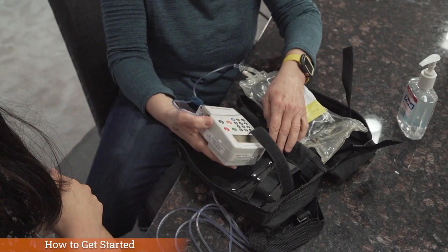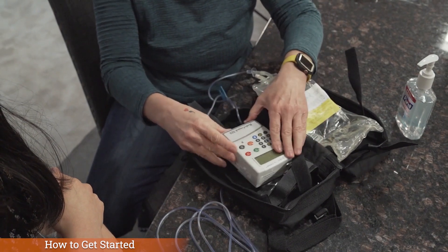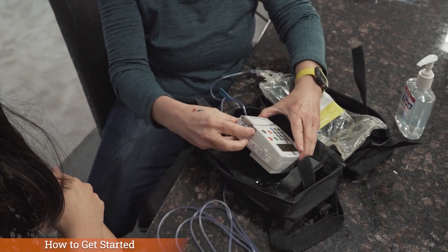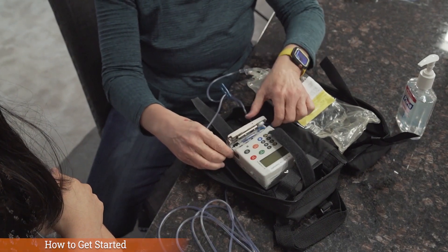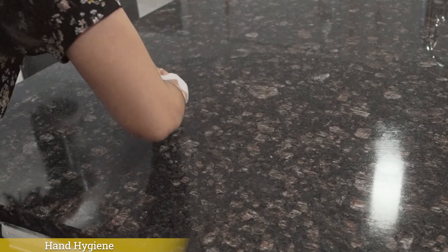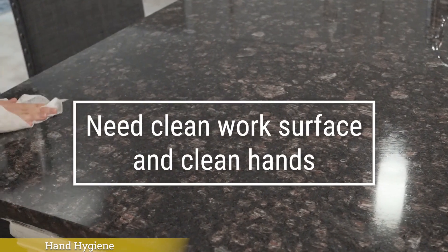Your pharmacist or nurse will also tell you how long each medication bag should run before it's time to change it again. You should change the bag at the same time each day on the days that you are due to change the bag. Now, the first thing to do is to make sure that you have a clean work surface and cleaned hands.